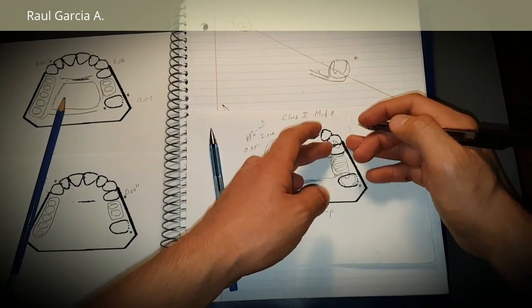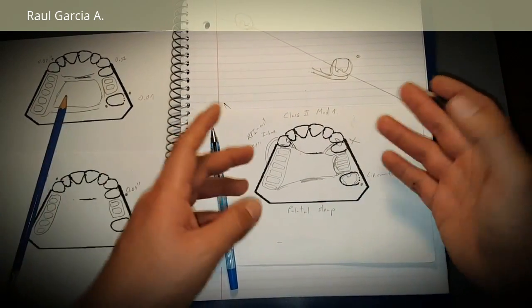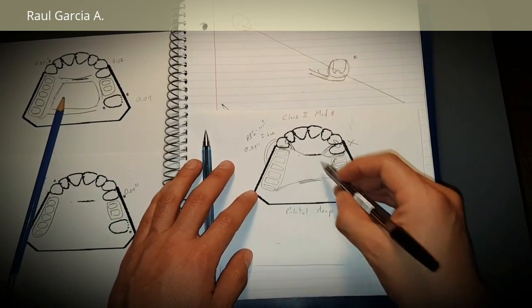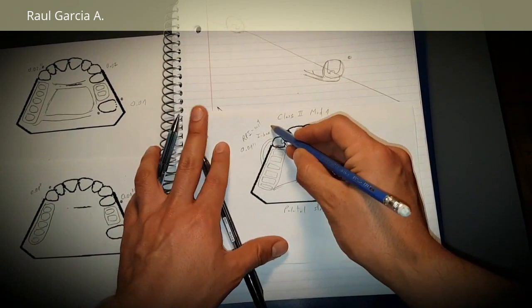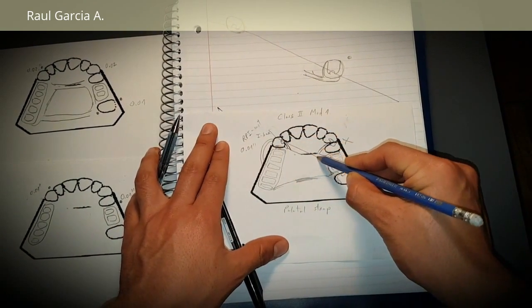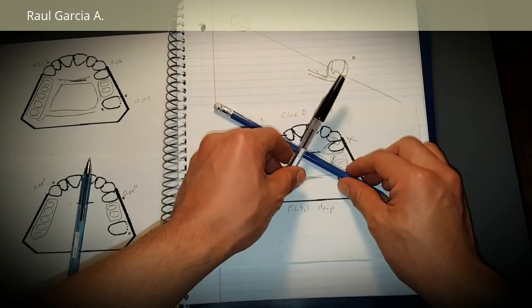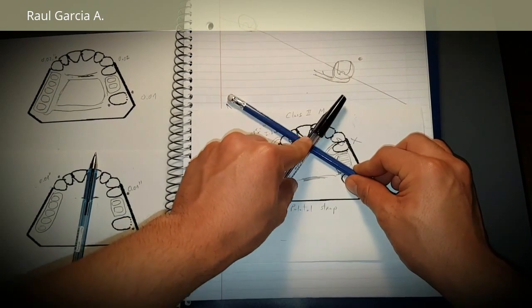In this case, we're not putting anything here, but we're going to analyze why we're putting wrought wire, which I already mentioned. So this is the fulcrum line. You can just draw it, just visualize it from rest to rest. See, everything ahead of the fulcrum line, I already mentioned the options that you have.